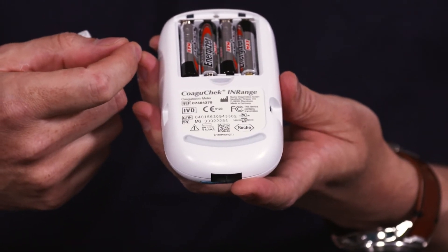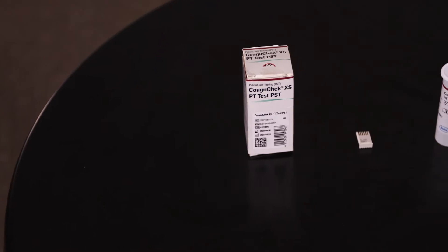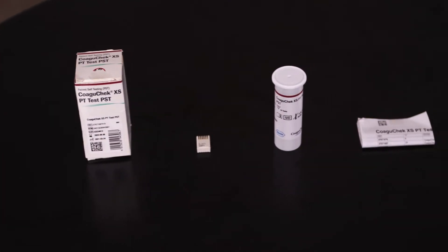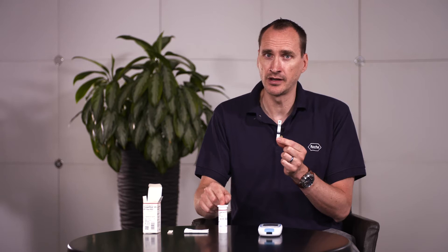When inserting the batteries please follow the symbols to insert them correctly. The pot of strips contains 24 individual strips. When removing a strip please ensure to put the lid straight back on the pot, and when handling the strips ensure you have clean dry hands.